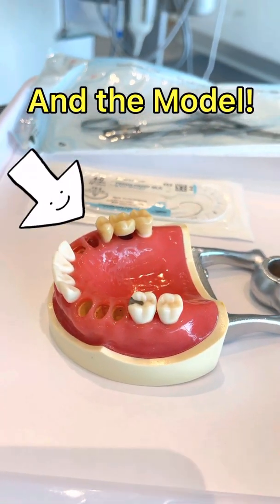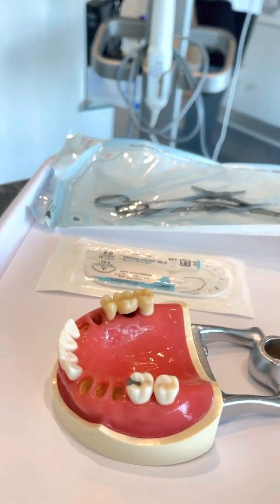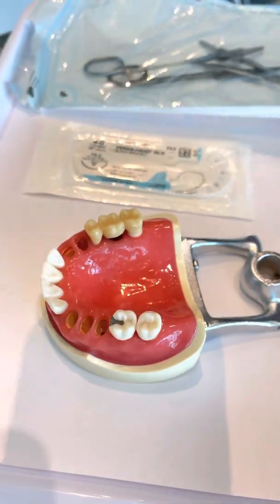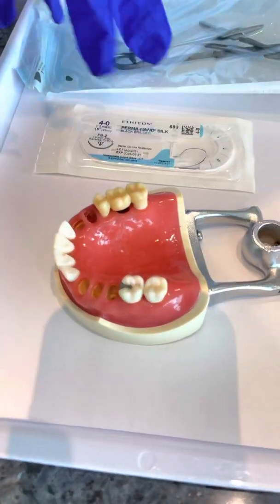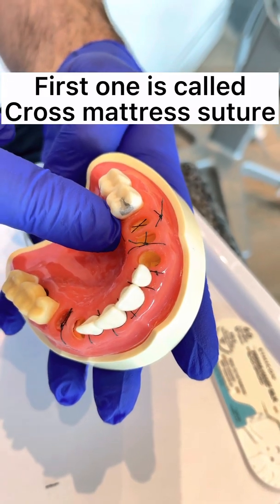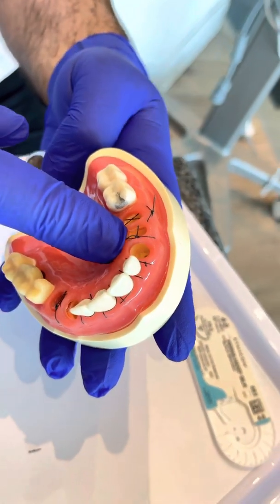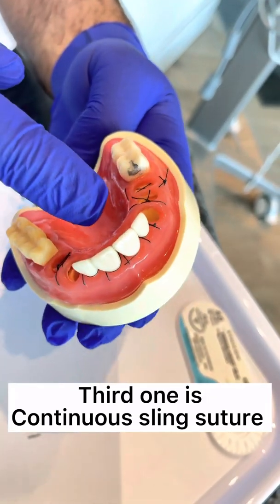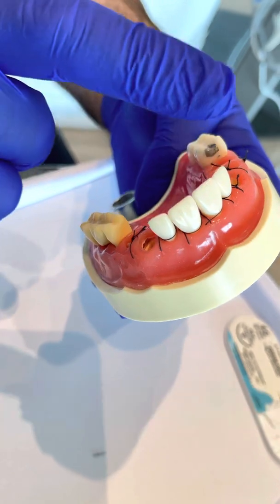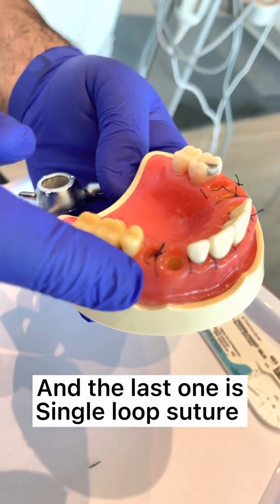And the model. The four types are: first, Cross Mattress Suture; second, Figure of 8; third, Continuous Sling Suture; and the last one is Single Loop Suture.